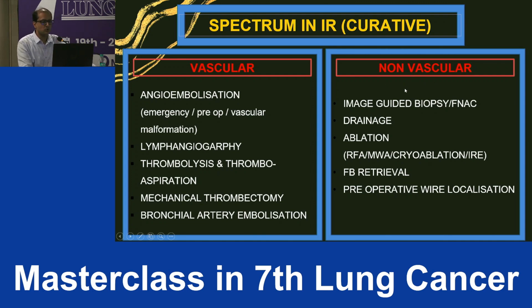Coming on to non-vascular, which could be image-guided biopsies and FNACs, which we have heard. Coming on to drainage in the post-operative setting, whenever there is empyema or an esophagectomy leak, that is the time when drainage needs to be done. Then ablations, the heat-based thermal ablation and non-thermal ablation. So radiofrequency ablation, microwave ablation, cryoablation, and irreversible electroporation.